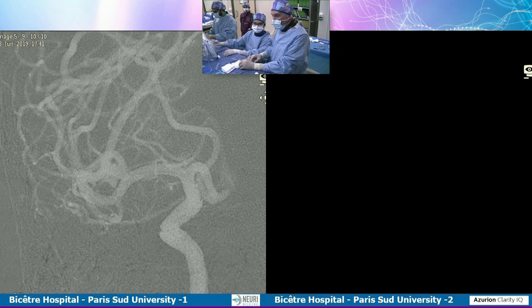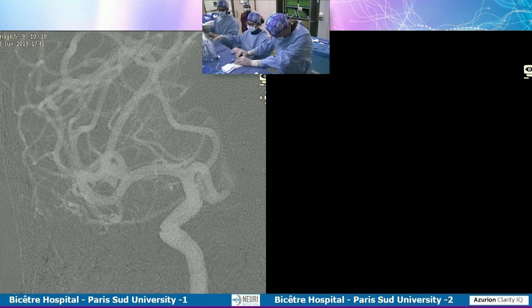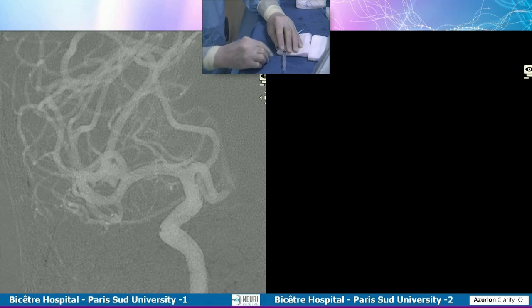So this was an issue. It has disappeared a little bit since now we are using a conjunction of ticagrelor with aspirin, which has decreased the thromboembolic complications we got within this covered branch. So we have decided to use a pipeline just to get rid of this small aneurysm.